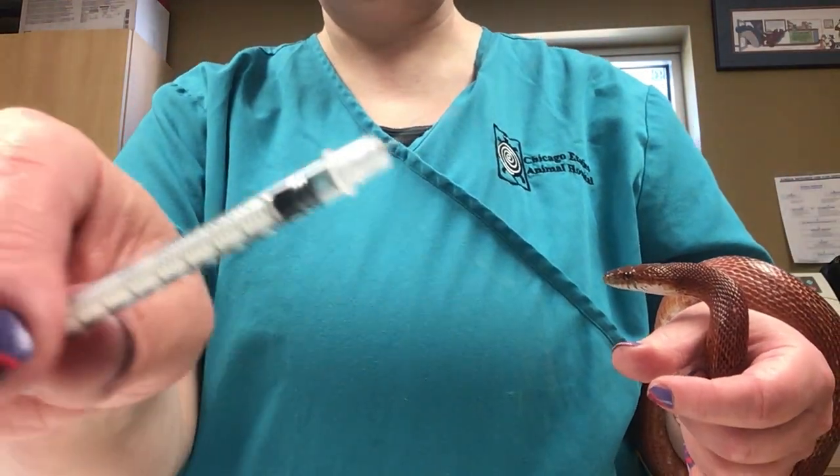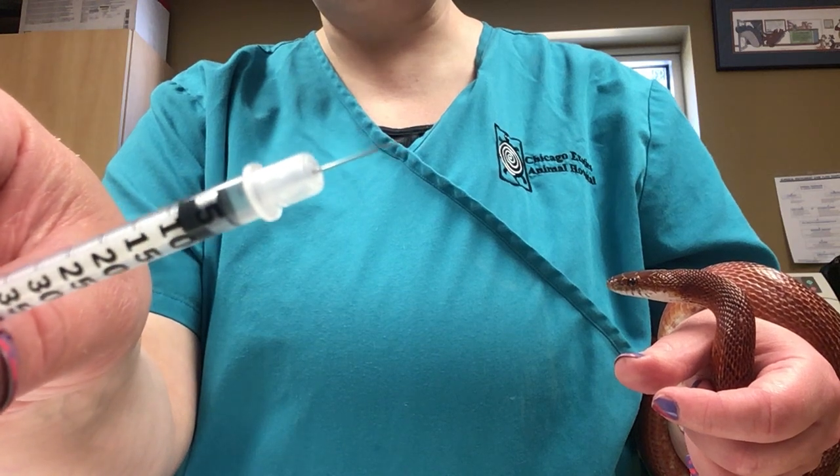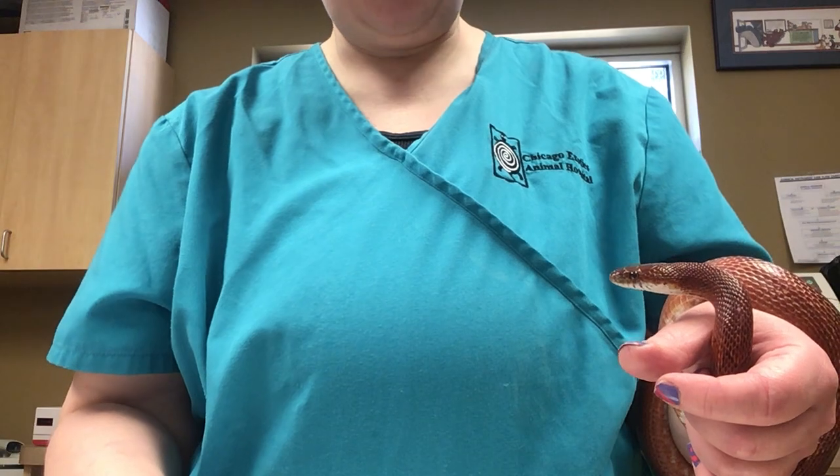When you look at the needle you will see there's a little bit of a bevel where the opening is on the side. We do like to have that facing upward when we inject — it just makes for a little bit of a smoother entry.